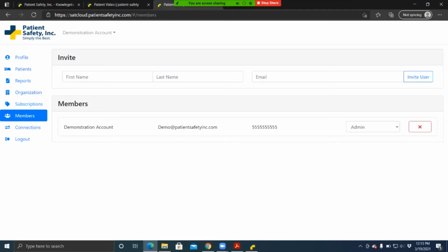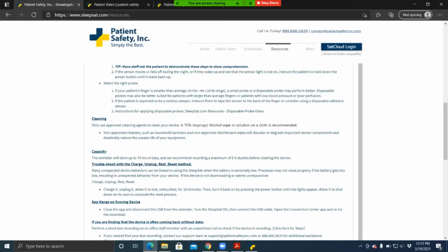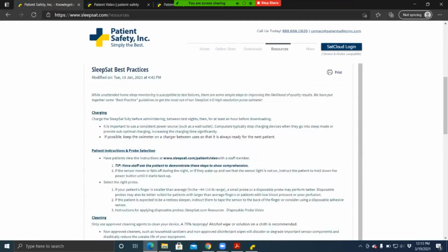All right, moving on, I'd like to go over the best practices for the SleepSat device. To get to that, we'll actually come back to our resources page. And under the FAQ and troubleshooting section, we've got the SleepSat best practices right there. Scroll back up. All right, we already reviewed some of the charging procedures for the device in that charge the device for an hour prior to downloading.